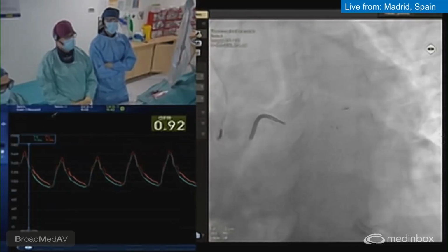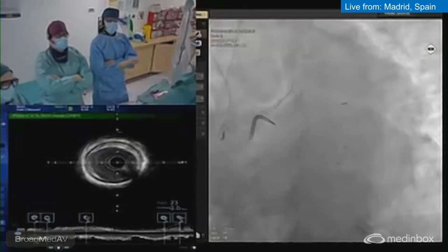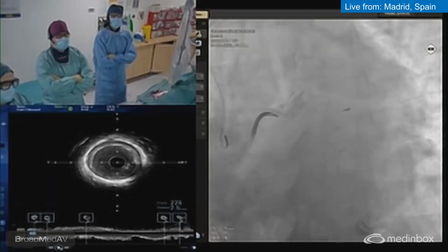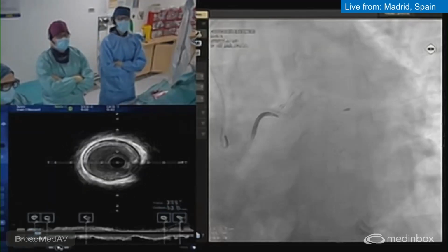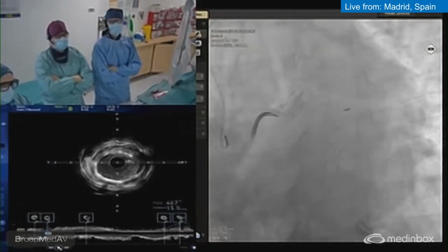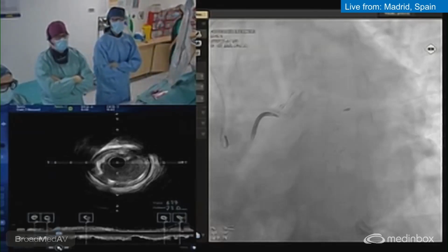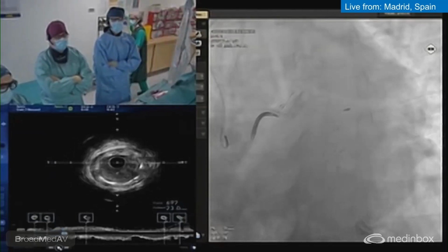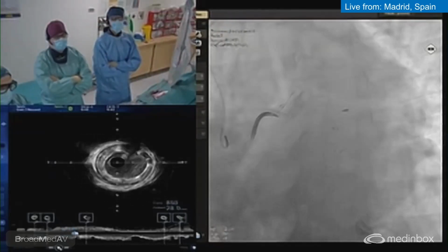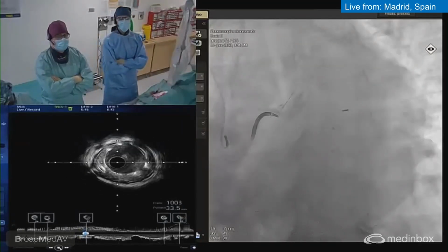Additionally, we have performed today another IVUS with the Boston IVUS. And we can show the whole pullback. This is the distal part. If you are seeing distal to the stents, the vessel probably is 3.0, something like that. This is the stent, the 2.5 stent. Well apposed, but probably not adjusted one-to-one to the vessel. I know the exact point of the overlapping segment, probably is there. And the proximal one is 2.75.